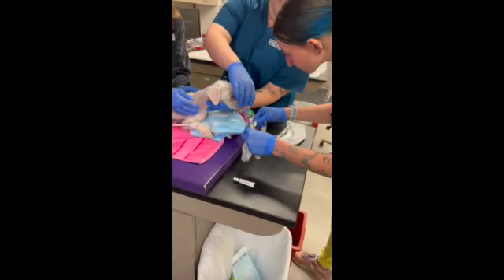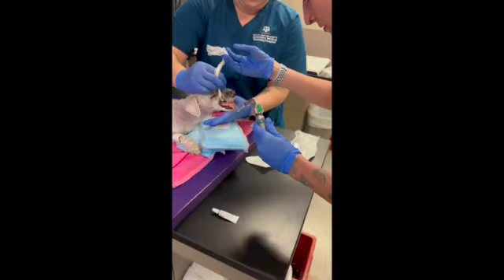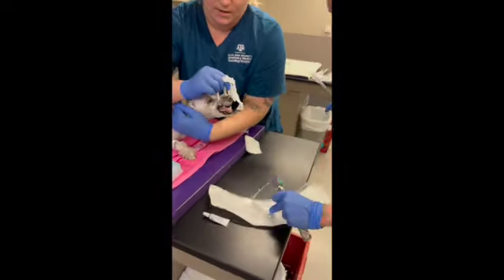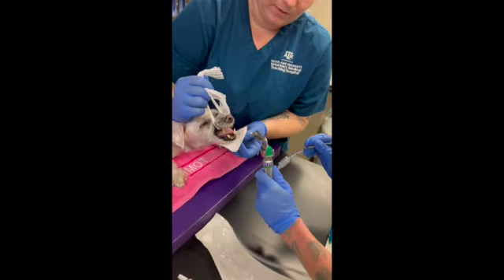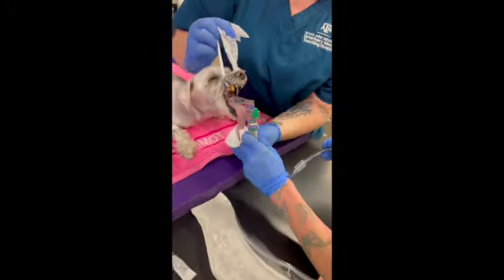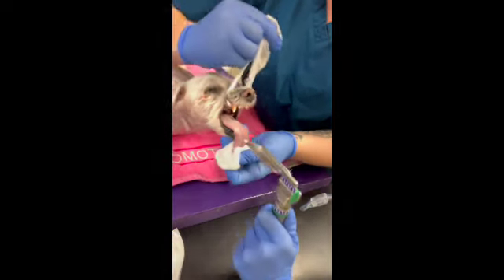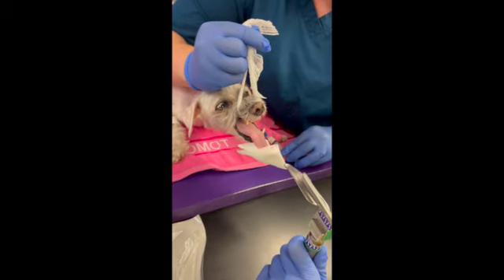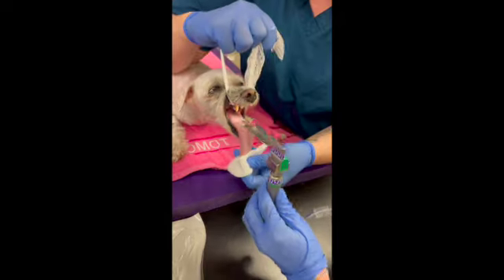Good boy. We need to pull him more forward for you. You can work with whatever. You just want to scoop that tongue out a little bit for me? Perfect. Alright, so we're just going to take the laryngoscope. Oh, big yawn. I might give him a little bit more really quick because he's still kind of stiff for me. Maybe that yawn was him settling in.